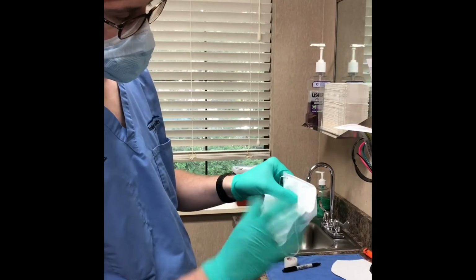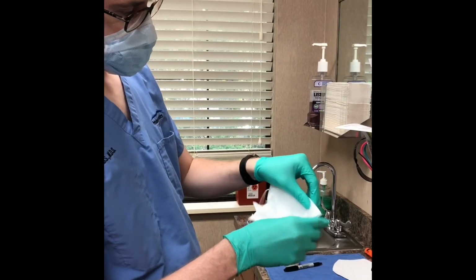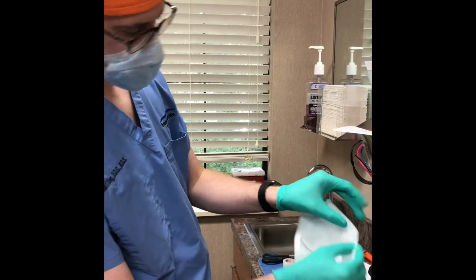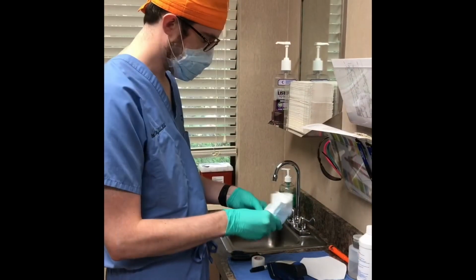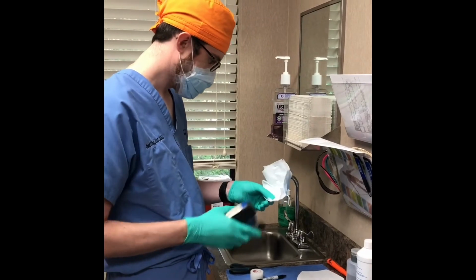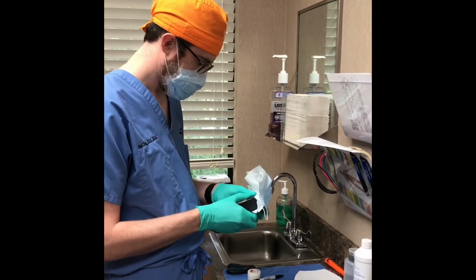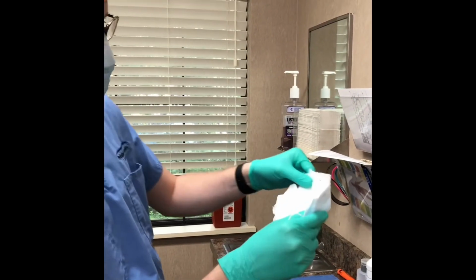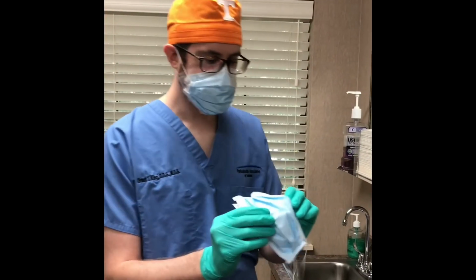And then once you've done that, tease up a little bit here in the top. Again, make sure that things are lined up, and then this one should be good. Okay, now that it's all stapled, you can get ready to fit it on your face.